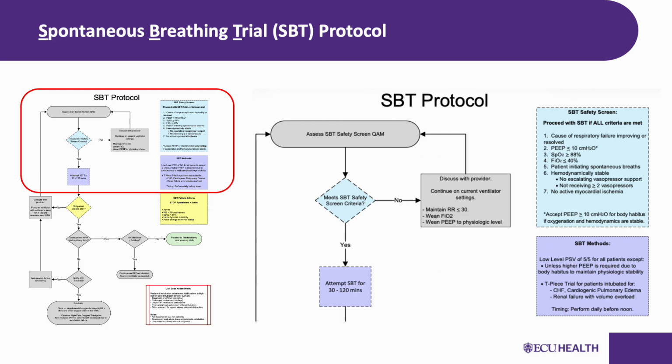Trust the trial, and our goal is to complete the SBT before noon whenever possible. That gives us the best chance to extubate the patient during daylight hours when the full care team is available.